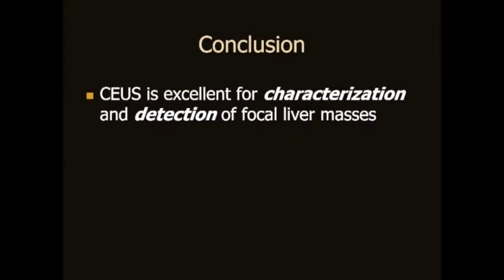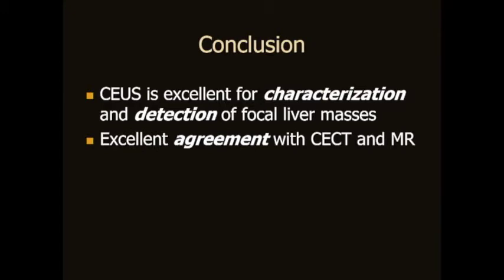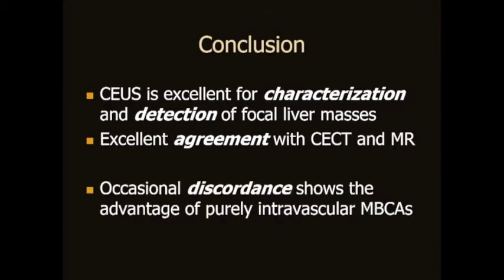So what do I believe? CEUS is obviously an excellent modality for characterization and detection of focal liver masses. And although it has excellent agreement with CT and MR scan, the instances when there is discordance show the advantages of purely intravascular microbubble contrast agents.